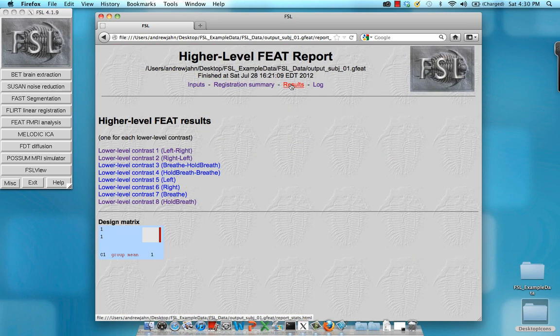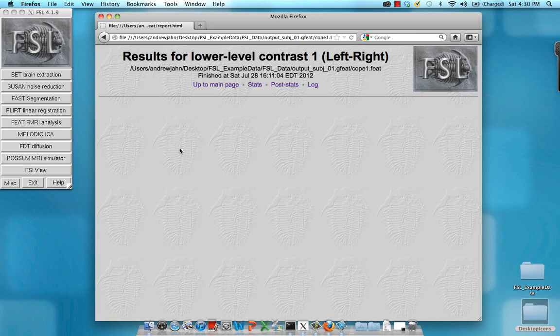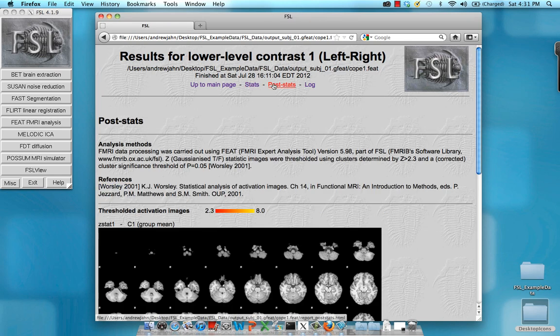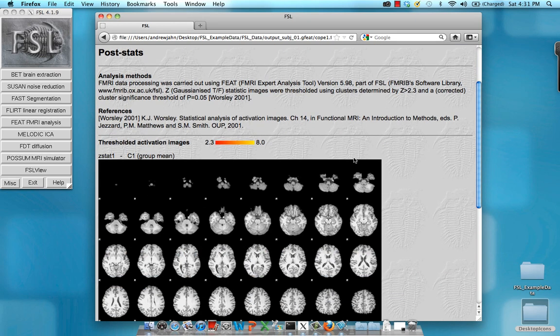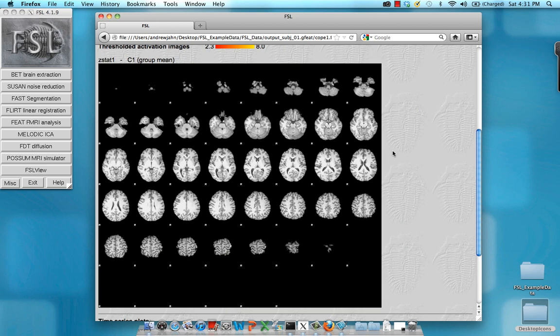If we go to results, we can see our group level results for each contrast. So for example, contrast left minus right. Again, I can look at the stats, and I can look at the post stats showing any activation at a given threshold rendered onto the brain.